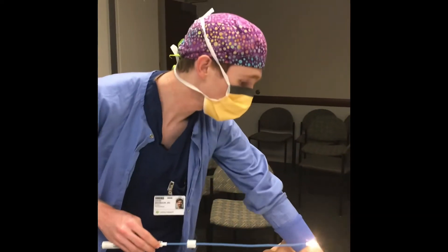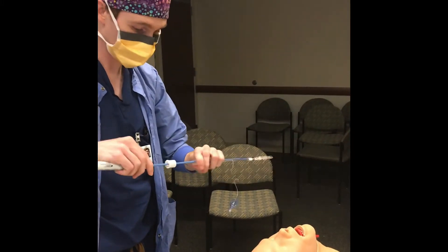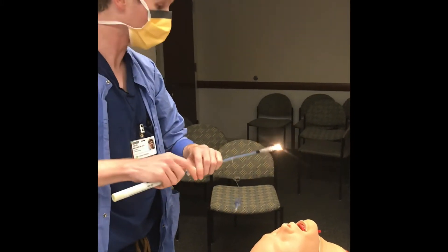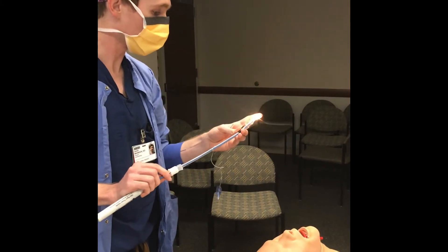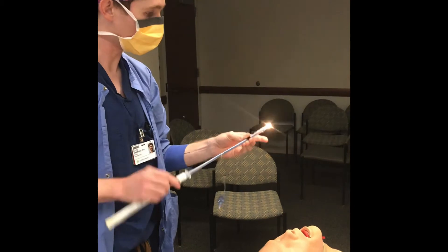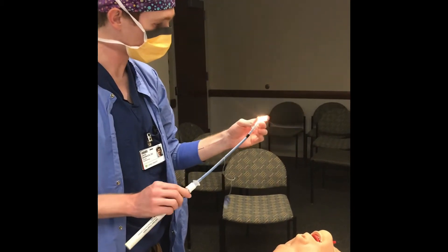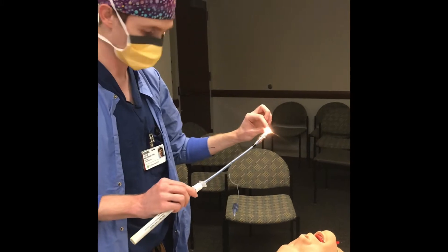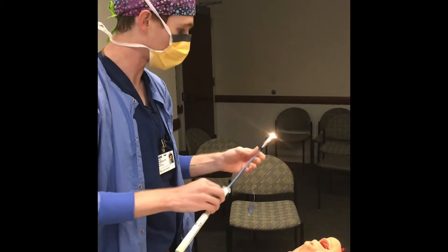You use this for a blind intubation, so you're not using direct laryngoscopy. You load your tube onto the stylet like you normally would. You can see a little bit of light coming out of the tip. This guides and keeps the edge of the endotracheal tube, and then it locks up with the piece that was on the stylet.